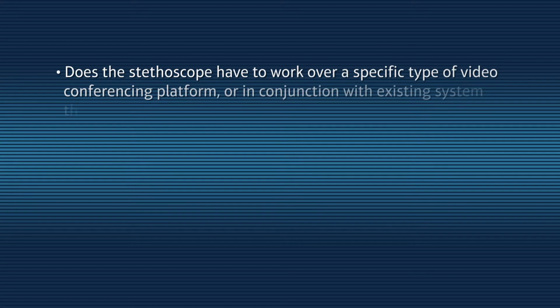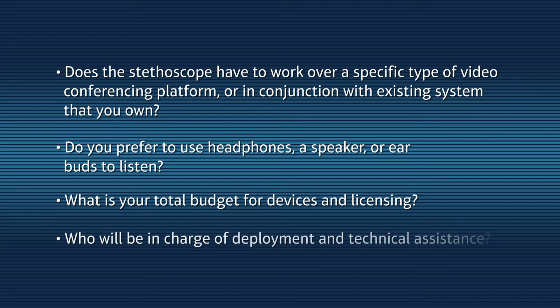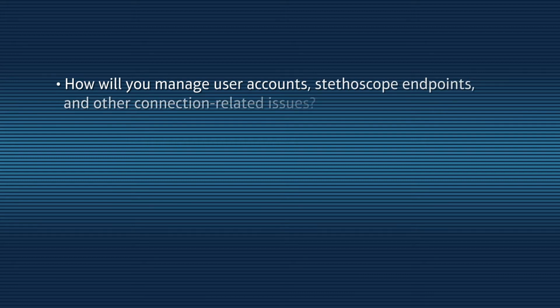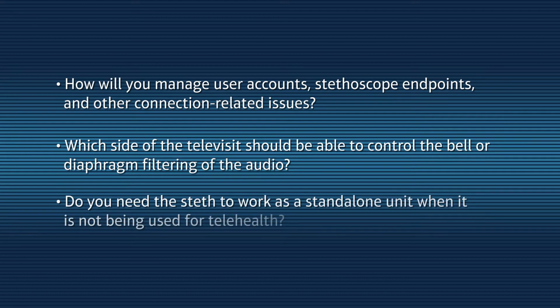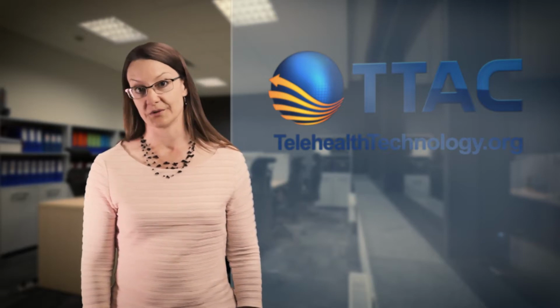For example, does a stethoscope have to work over a specific type of video conferencing platform or in conjunction with existing systems that you own? Do you prefer to use headphones, a speaker, or earbuds to listen? What is your total budget for devices and licensing? Who will be in charge of deployment and technical assistance? How will you manage user accounts, stethoscope endpoints, and other connection-related issues? Which side of the televisit should be able to control the bell or diaphragm filtering of the audio? Do you need the Steth to work as a standalone unit when it's not being used for telehealth? There are many other questions and requirements that you may need to explore when selecting your own stethoscope.